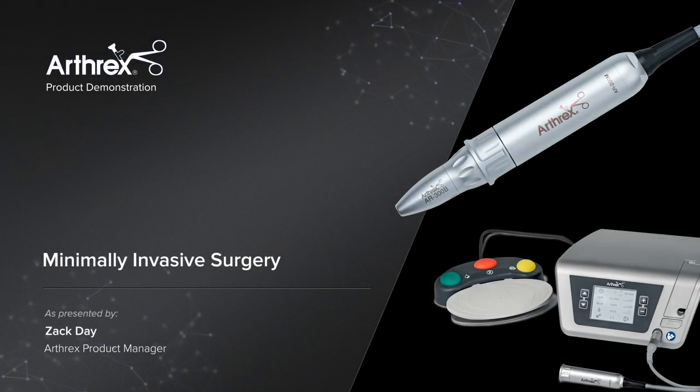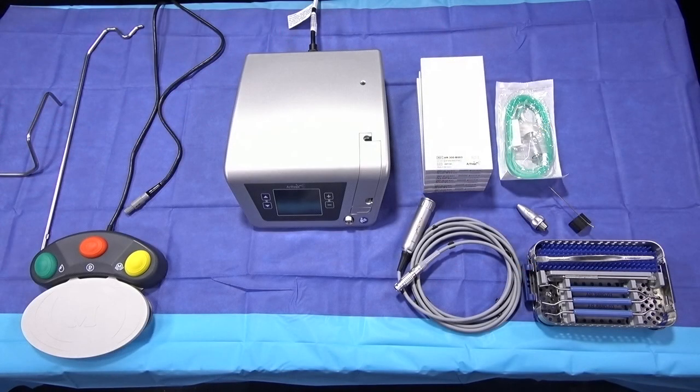Hi everybody, this is Zach Day, product manager for this minimally invasive surgery product launch. I wanted to walk you through how to set up the new AR200 power unit, how to attach the burrs, the pump tubing, and then we'll go over the benefits of the minimally invasive surgery product line.